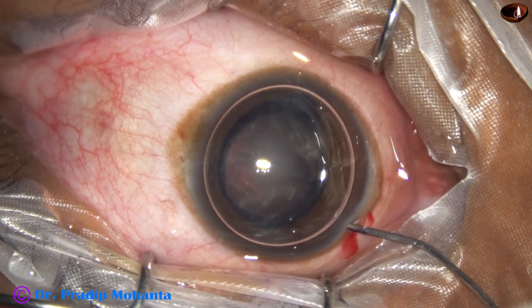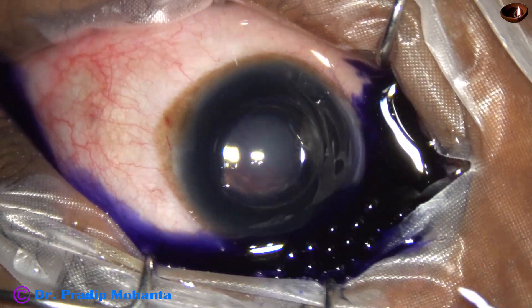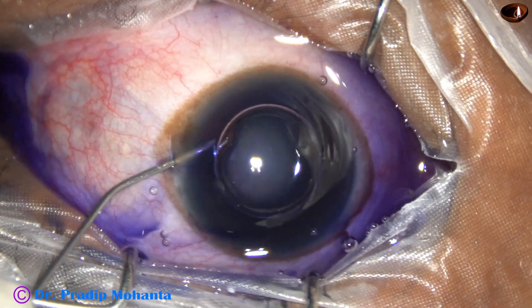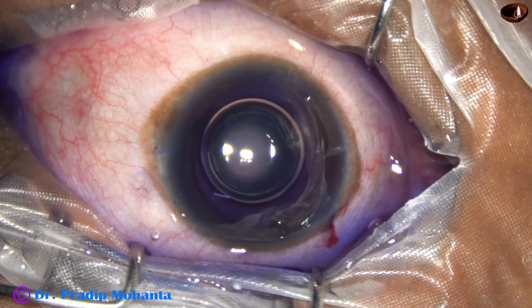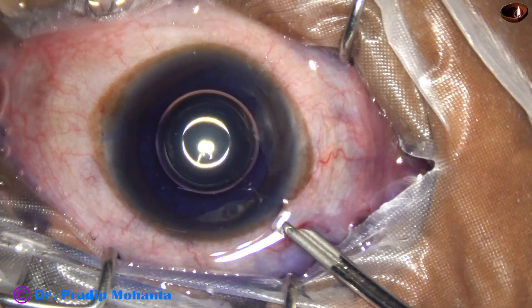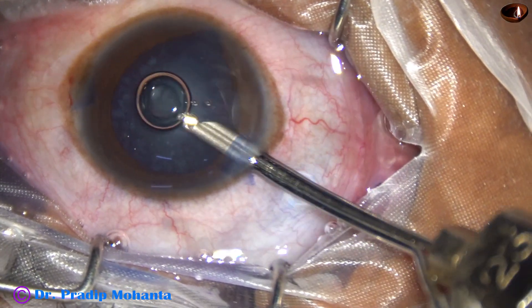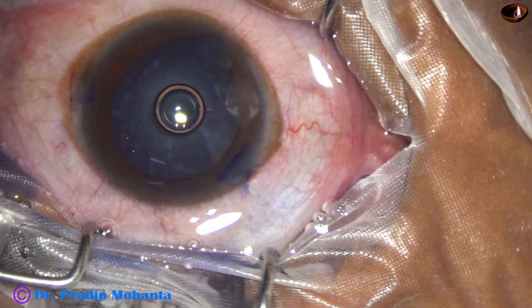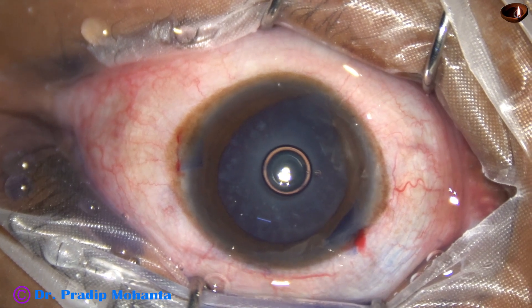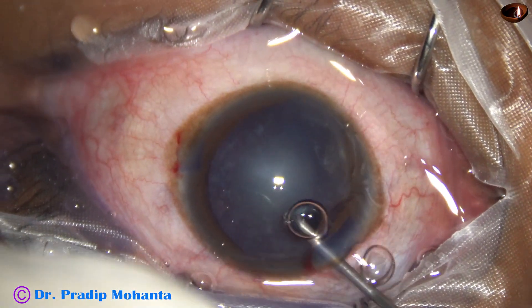My plan is to stain the anterior capsule with trypan blue dye. Here goes the dye underneath the air bubble. This is adrenaline, and now the dye is washed out. The anterior chamber is then filled up with 2% hydroxypropylmethylcellulose.